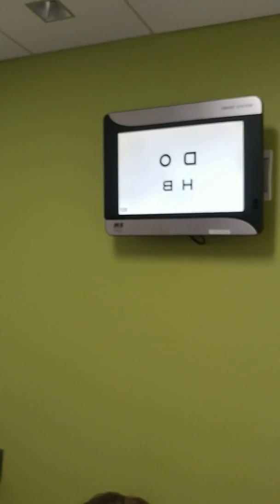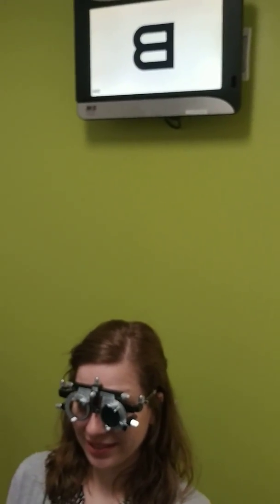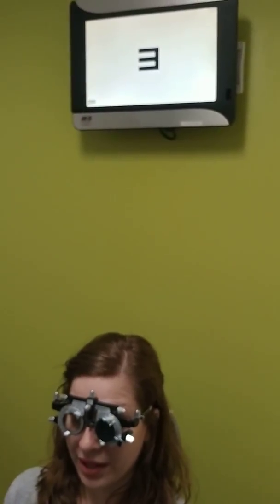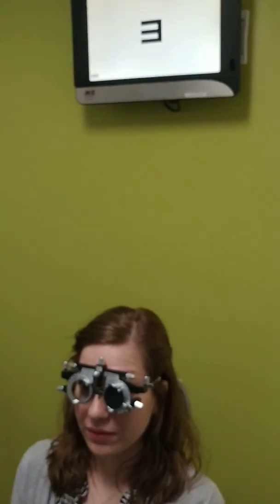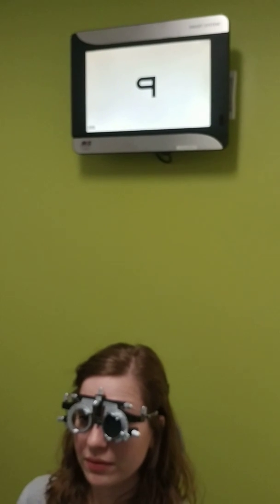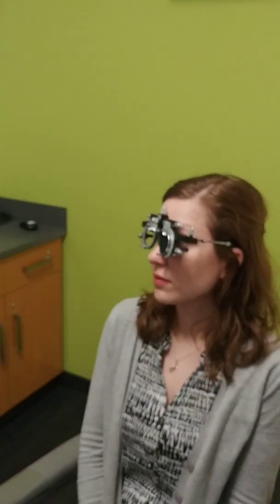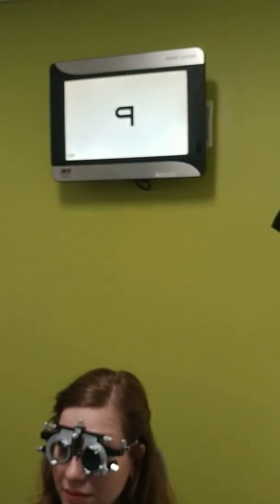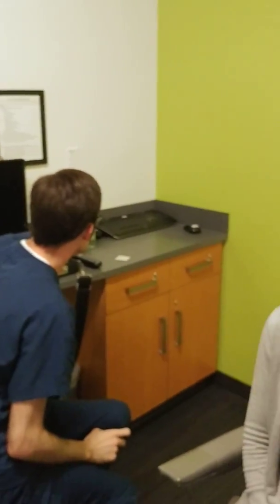She can see what looks like two squares on top. You can always randomize the letters. Ideally you would like to have more than one letter, but for this demonstration we're just going to use a Snellen chart and not a LEA chart or another type of chart. She's seeing 20/200. That means she's a theoretical low vision patient and I need to make changes of a total of two diopters for her to tell.